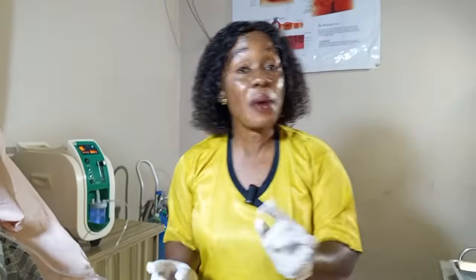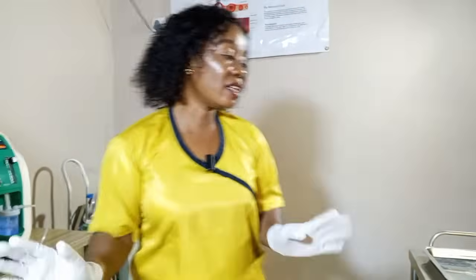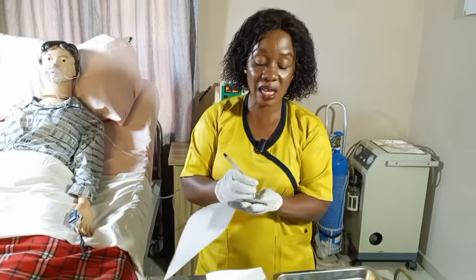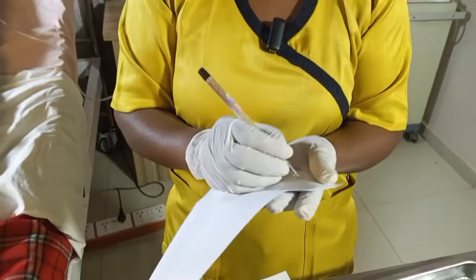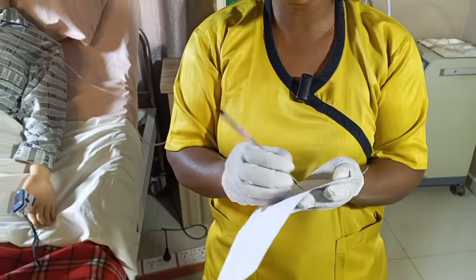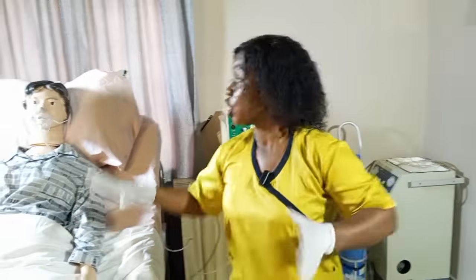Remember, we have taken the oxygen saturation before administering the oxygen. Now keep recording the oxygen saturation — maybe every 30 minutes, 1 hour, or 15 minutes. You have to record the prescribed oxygen that you have administered: oxygen was set at 10 a.m., 3 liters per minute, and the patient is still on it. If it is in the ward, after recording, you leave the patient this way.